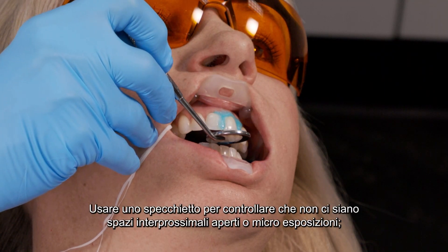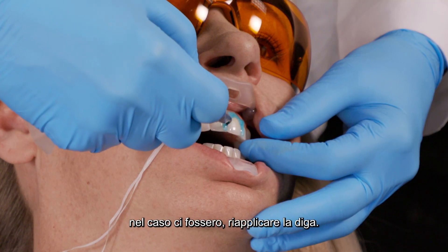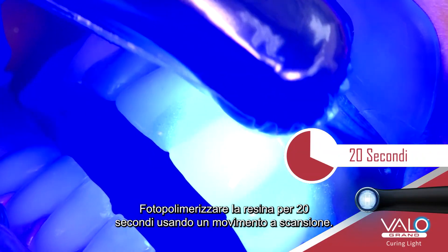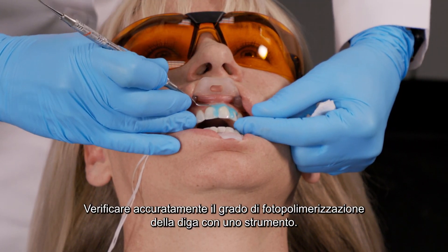Using the mouth mirror, look up the long axis of the teeth for gaps or minute openings exposing underlying tissue and reapply resin. Light cure the resin for 20 seconds using a scanning motion. Carefully check the resin cure with an instrument.